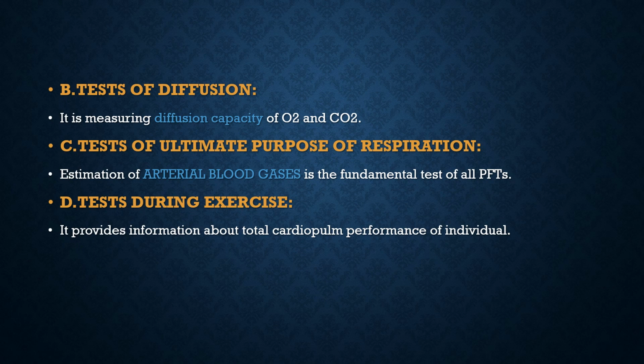So now we'll see the tests of diffusion. So the diffusion refers to transfer of gases from alveoli to capillary blood across the respiratory membrane. The exchange of gases in the lungs was earlier believed to be dependent merely on the ability of gases to diffuse across the respiratory membrane. Therefore, the term is diffusion capacity. So the diffusion tests are done by measuring the diffusion capacity of oxygen and CO2.